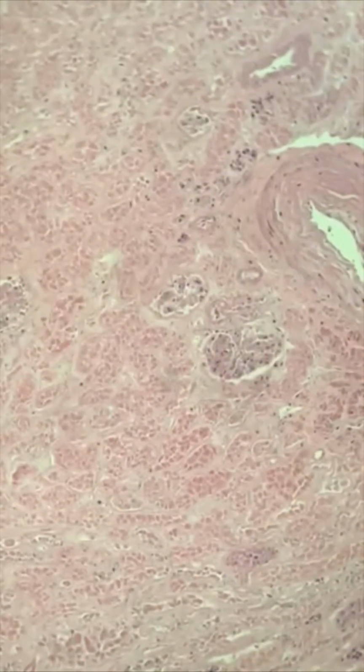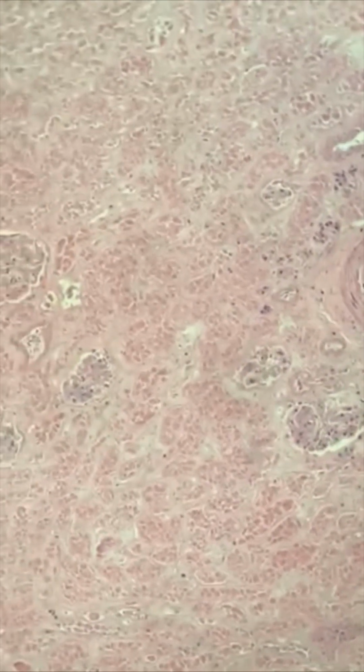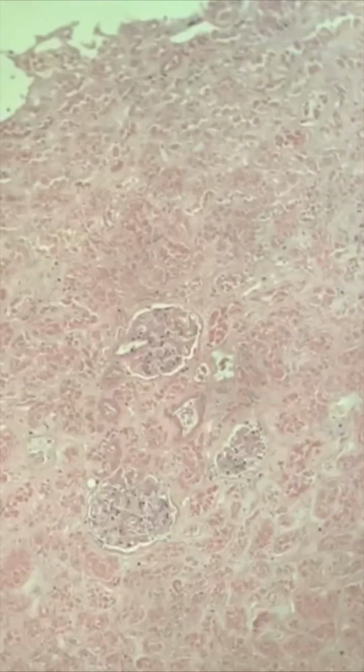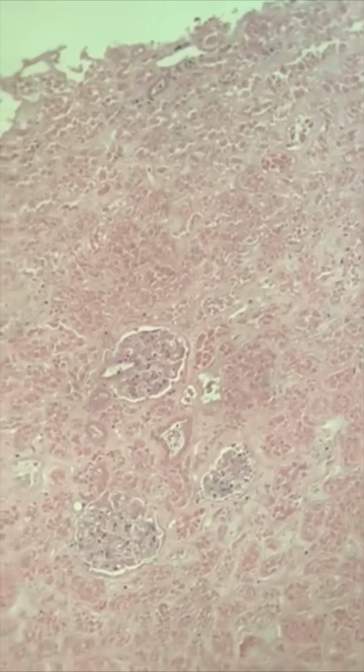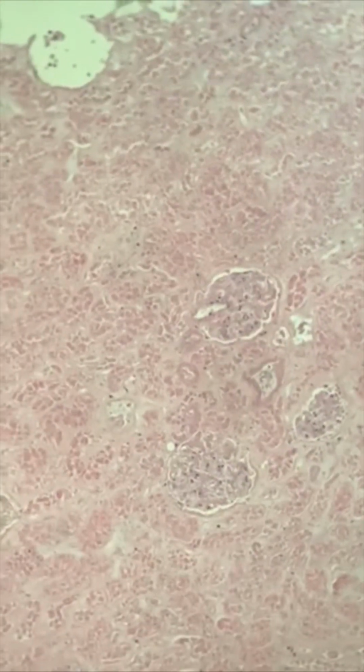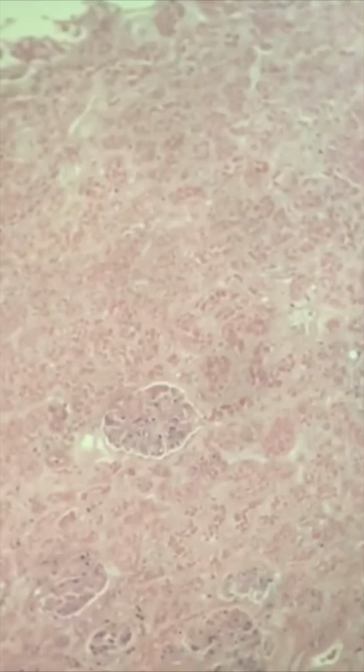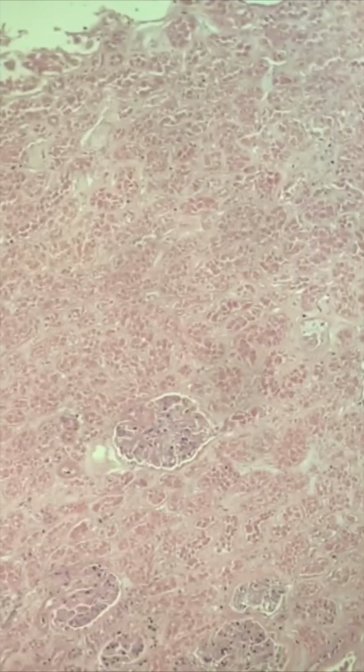You see some glomeruli which look like they're okay, obviously degenerating. But look at the surrounding tubules, completely necrotic. We call that acute tubular necrosis, perhaps due to cardiogenic failure. In other words, the heart stopped, or it was not getting much oxygen supply from a failed lung respiration.